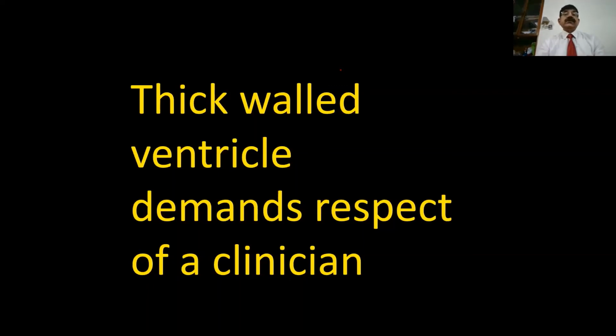And if you still have hypertrophy, we have counted nearly 15 points for hypertrophic cardiomyopathy. If most points are being met, it is hypertrophic cardiomyopathy, but if only few points are being met, my suggestion is do a study again with better hemodynamics. And of course, family history is important, hypertension, all that is important. You will be able to reach a conclusion. It's not that difficult. The real issue is only 1-2% cases. Most of the time we are able to differentiate.